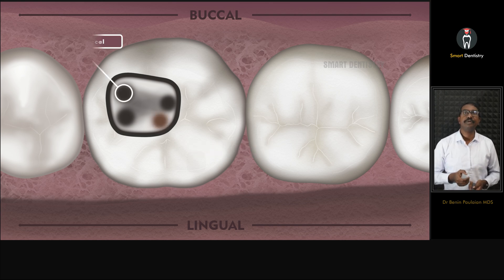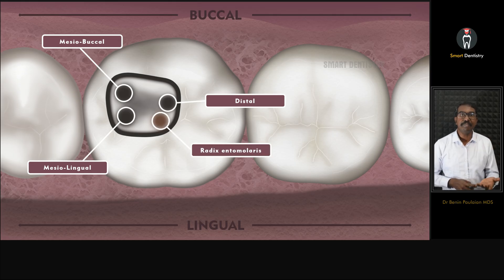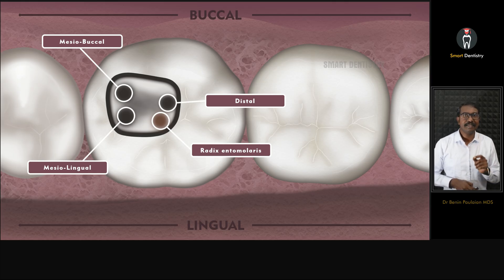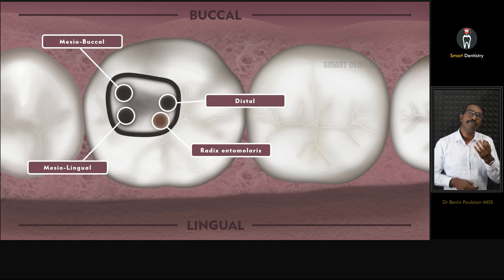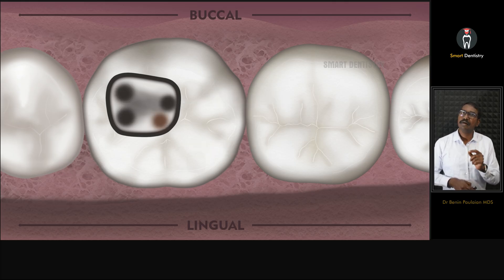This location may vary a little from tooth to tooth, but most often you can find it in that area. Take a DG16 explorer and scrape in the pulp floor, or use a size 15 K-file, and try to locate the radix in this location. That will be the first tip for locating the root canal orifice of a radix endomolaris.